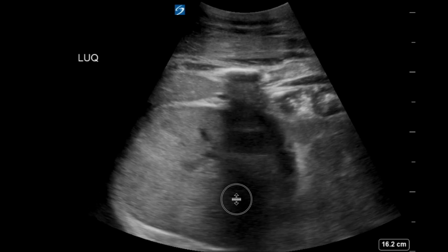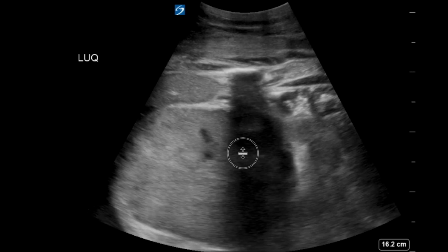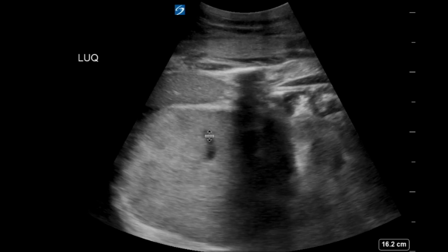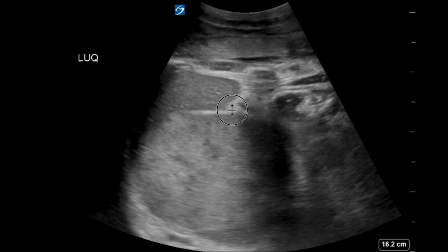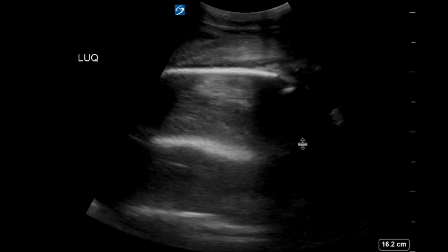Yeah. So this definitely looks different than a normal renal cyst, right? Mm-hmm. So renal cysts are usually anechoic and small, usually benign ones less than 5 centimeters. But you have this heterogeneous, solid mass-like structure in the area where the kidney usually is. Okay. And then you have some central clearing here, which may be a small amount of fluid within it internally. So what do you think this may be? If it's a solid mass on the kidney, less likely to be some sort of cyst, and worrisome for a potential carcinoma or cancerous growth.